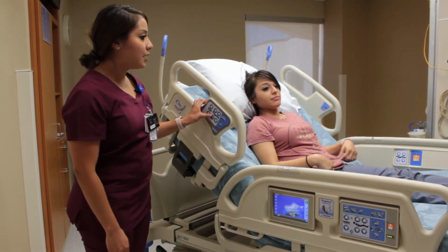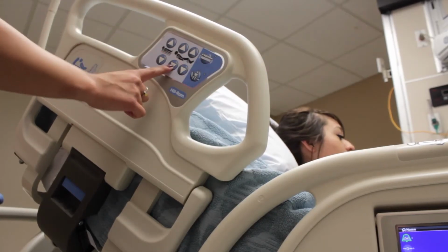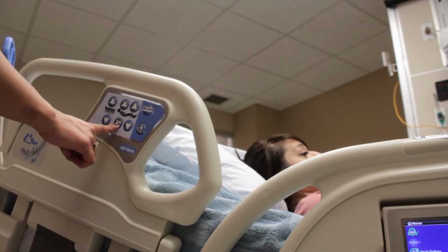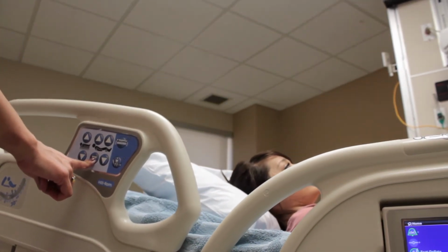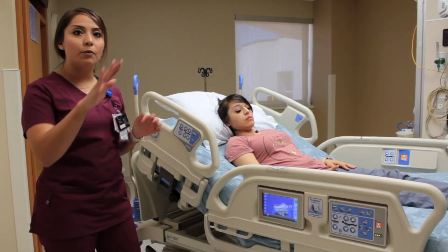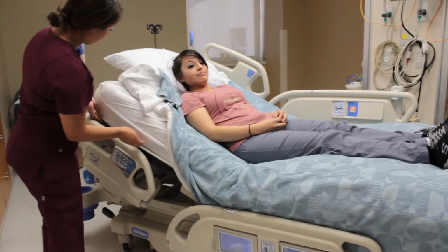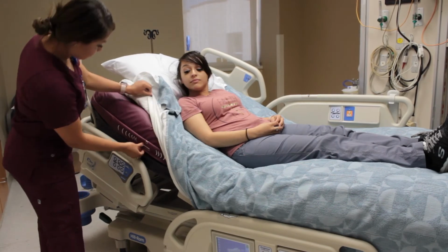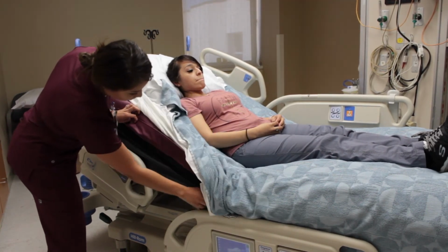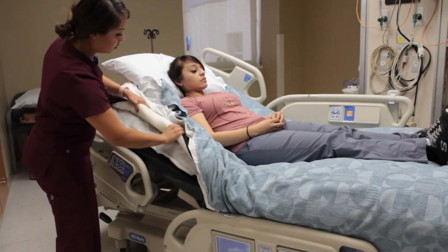Another thing that's very nice about this bed is it does detect the patient's weight and body shape. So the bed conforms to the patient's body pretty much. So if there's a patient that's very heavy set and has lots of pressure on their bottom, it will sink in to where it helps release the pressure on their bottom. It has an area that allows for radiology to place their cassette for x-ray with minimal interruption and discomfort to the patient. Slides in easily, and it is also easily removed without having to reposition the patient several times.